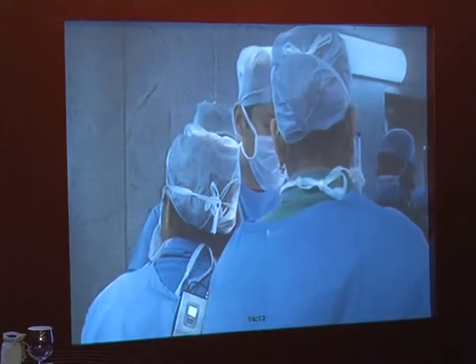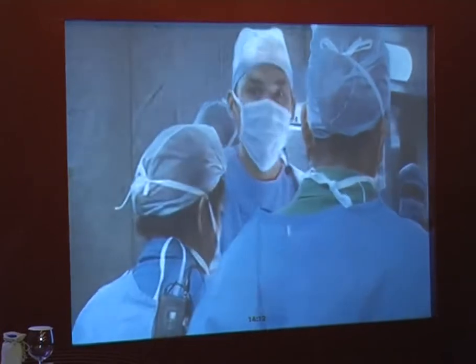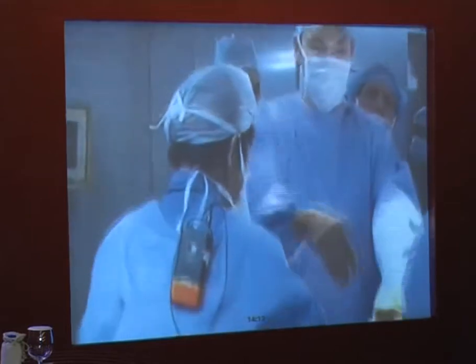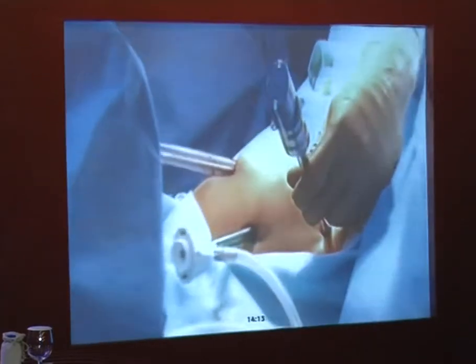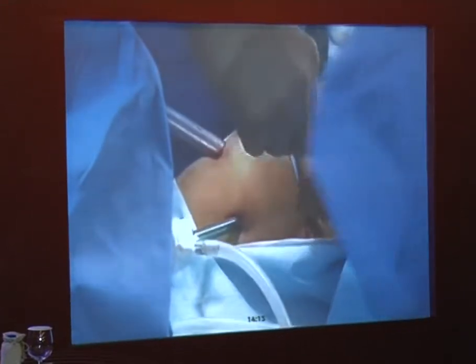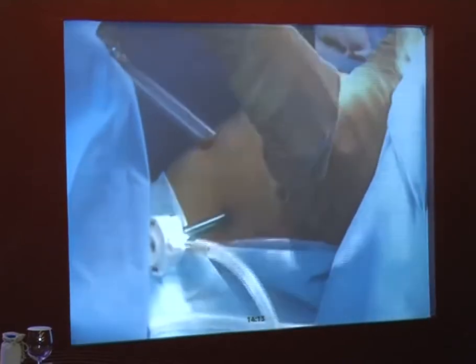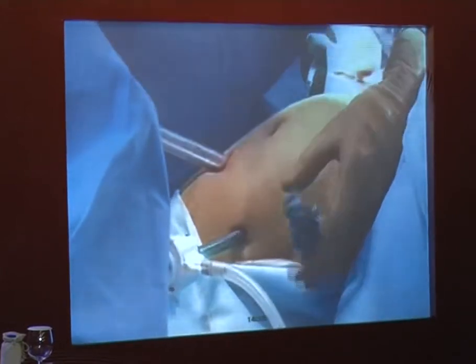All right. Can you show them the configuration? Okay, let's take this here. What we have here is, here's the umbilicus right here. Can you guys see this over there? Yes, we can see that. We have a good view now. So we've got the umbilicus here. I'm about 3 finger breadths above the umbilicus with the camera port to compensate for the large uterus and for the fact that we'll be telescoping a myoma out towards us.